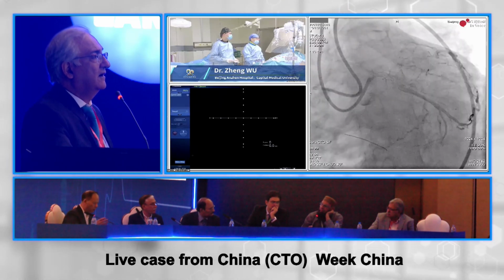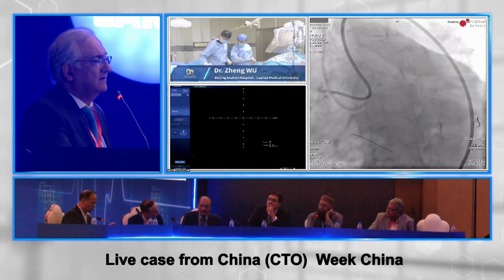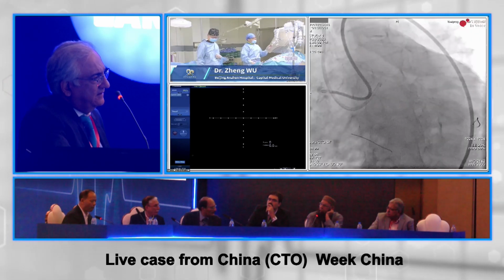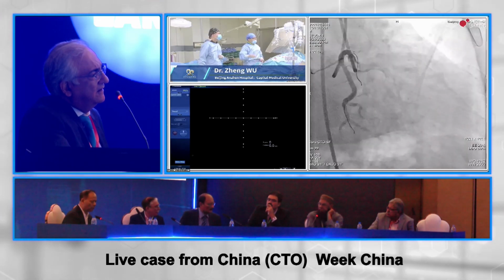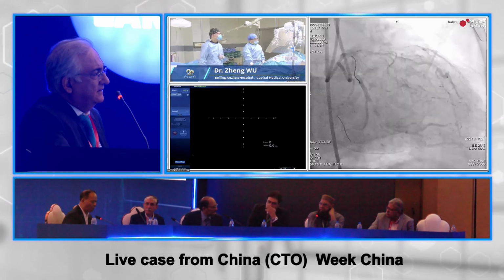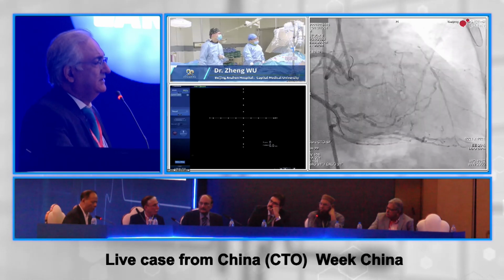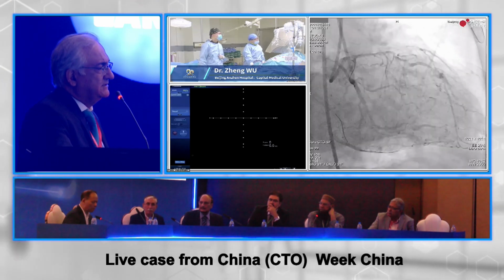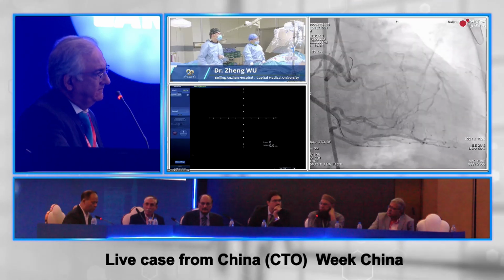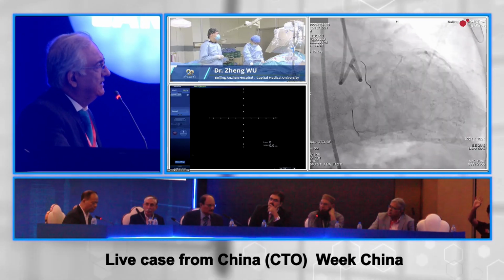Thank you, sir. I totally agree with you. From the right side to the left side, our primary strategy is antegrade wire escalation. If antegrade wire escalation fails, the bailout is retrograde wire escalation. Having said that, it's not a case for dissection re-entry because it's a long segment. So antegrade and retrograde wire escalation will work here. Okay, that's a good thought.